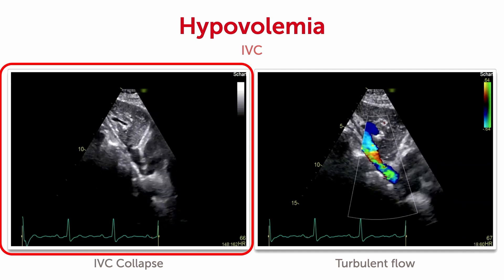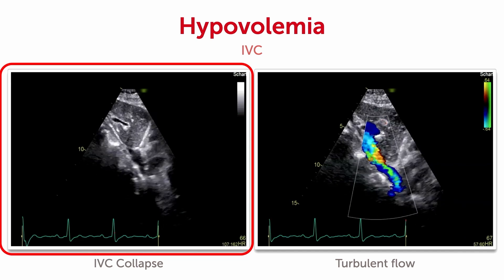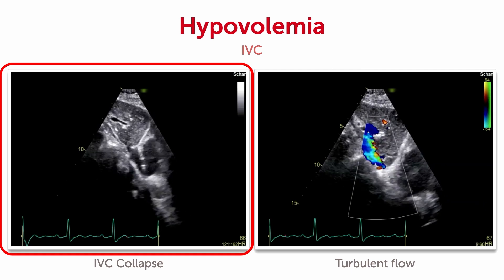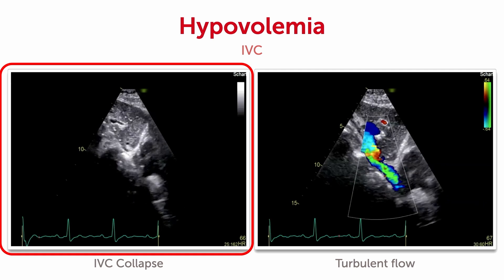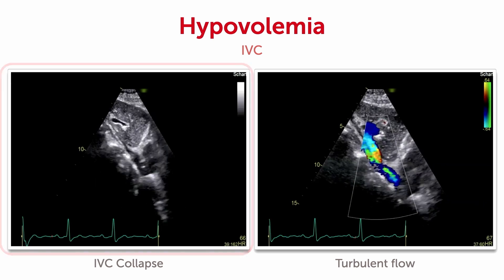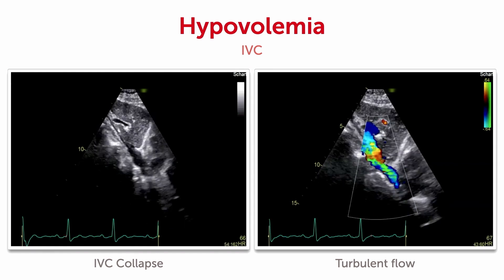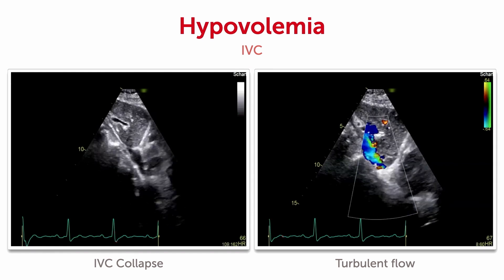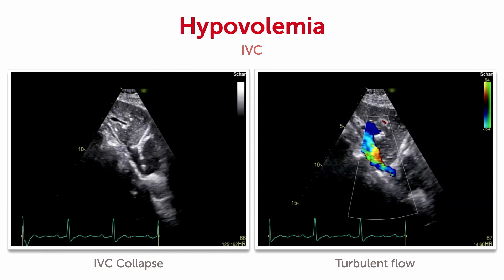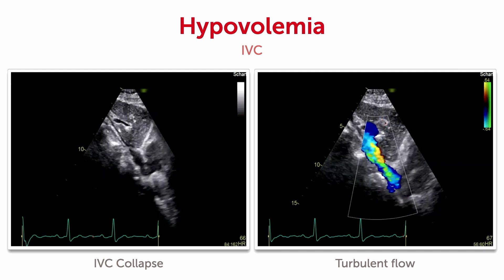This echo is from an elderly lady who was found unconscious in her home simply because she was hypovolemic — she just didn't drink enough and had diuretics on board. In such a situation it's sometimes very difficult to find the IVC because it's so narrow, but one thing I would recommend is to use color Doppler.